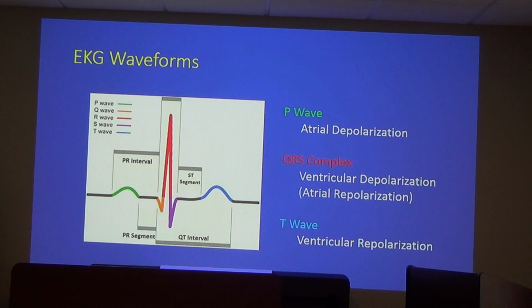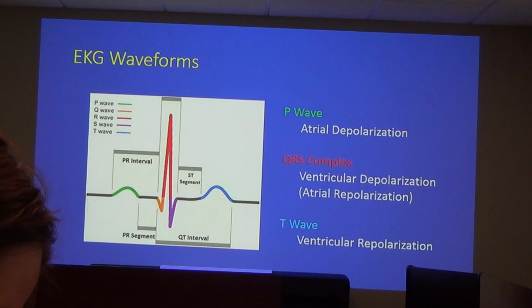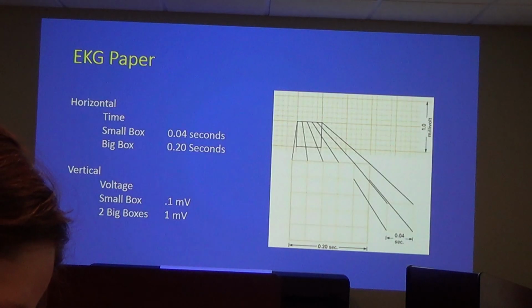So in the middle, you'll see a bundle branch block. If it's a full bundle branch block or an incomplete bundle branch block, you'll see it in the QRS duration and the QRS shape. The QRS is wider if the bundle branch isn't functioning normally. I put all this in EKG because I like to talk about EKGs.